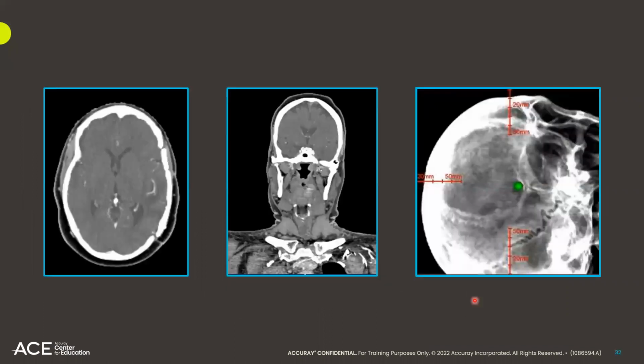On the last slide, we saw some poor examples of DRRs. Now let's look at what is considered acceptable. Here we see examples of how a high contrast skull CT scan produces a DRR with crisp edges and clear feature-rich anatomy, which is especially important in the facial bones for the system to determine pitch, roll, and yaw. We can see here how having that 1 cm gap anterior and superior to the skull provides the system with that little bit of background to help determine translations.